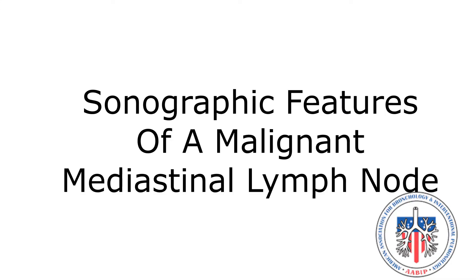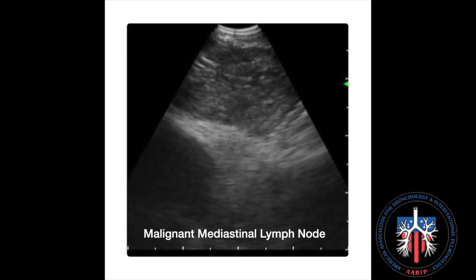Sonographic features of a malignant mediastinal lymph node. This is an ultrasound image of a malignant lymph node using a linear EBUS bronchoscope.